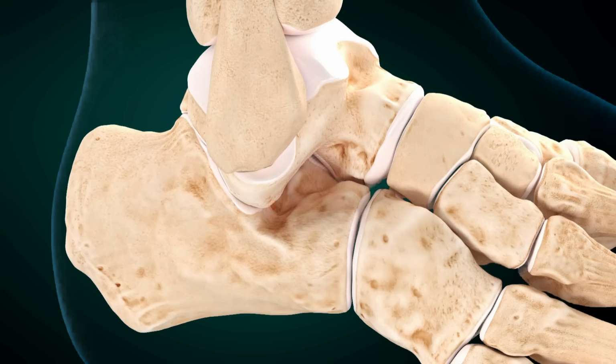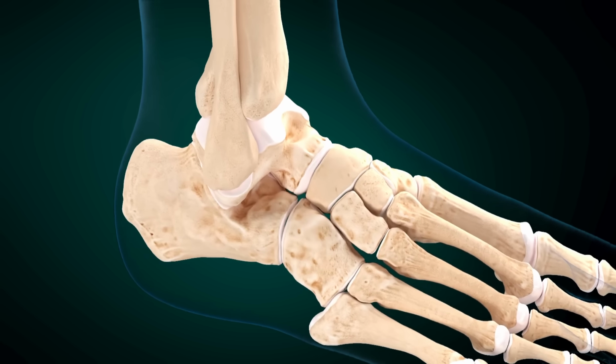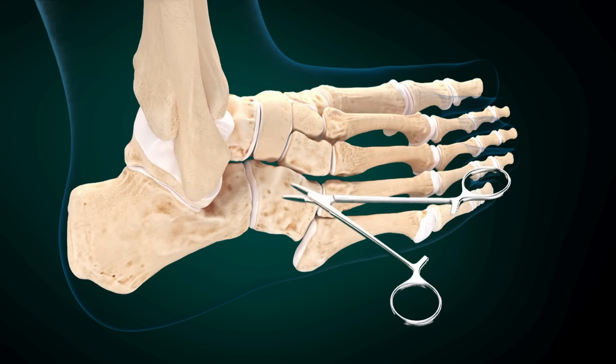The surgical technique to implant a Prostop subtalar arthroereisis implant is simple and straightforward. A skin incision is made in the soft spot of the sinus tarsi, just proximal to the anterior process of the calcaneus. Blunt dissection of the subcutaneous tissue is carried out with the hemostat. The dissection of the interosseous ligament is not necessary for this procedure.